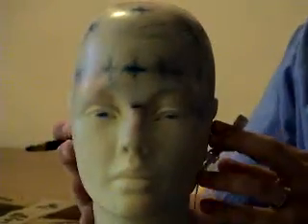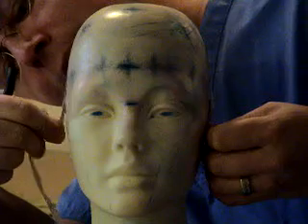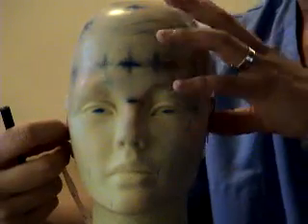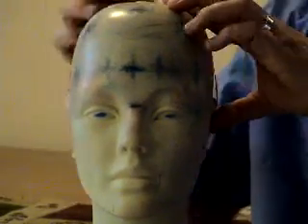The next step, you're going to measure from preauricular crease all the way across the top of the head to the other side, and we get 29 centimeters. Half of 29 is 14.5. And I'm making a mark just across the top, which is now known as CZ. In order to obtain a mark or a point on the head, you have to have two lines, basically an XY axis. The head is kind of marked out as a grid.